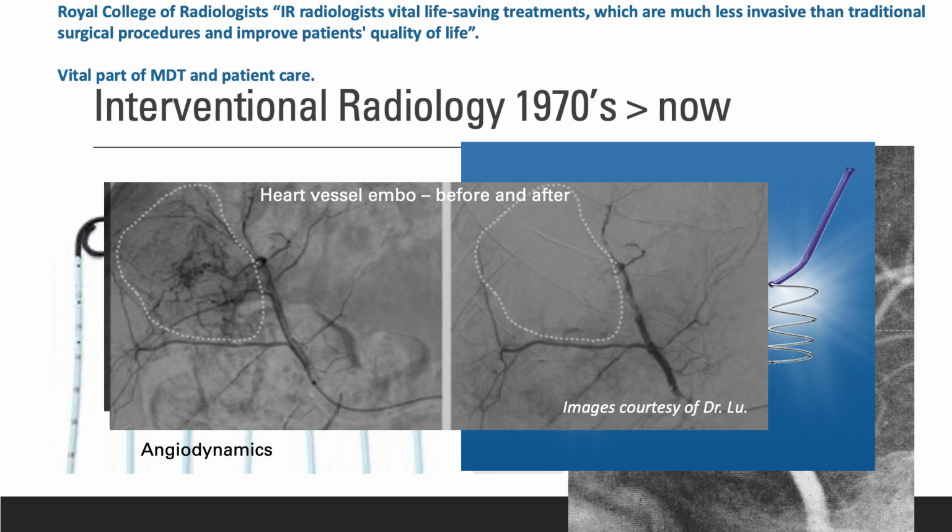This was one of the first angiograms done of the brain, of the left internal carotid artery. You can see this big bulbous thing here, which was actually an aneurysm, and obviously they run the risk of bleeding. But nowadays, it's much more like what we have. Thanks to Siemens, when we're in Vienna, they have a big van which has one of these in it. You might see them on the roads around here, moving between hospital sites, and not just Siemens, there are other companies.